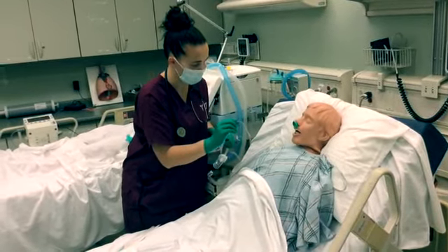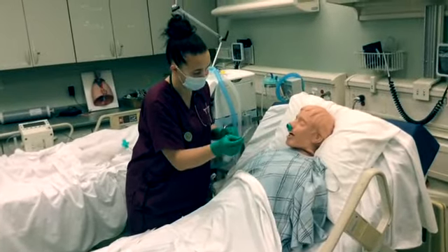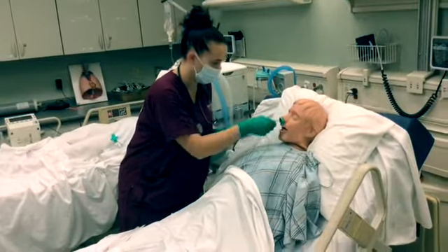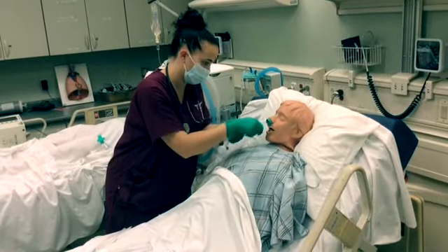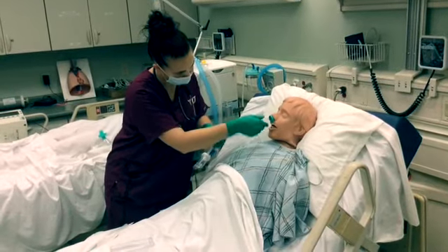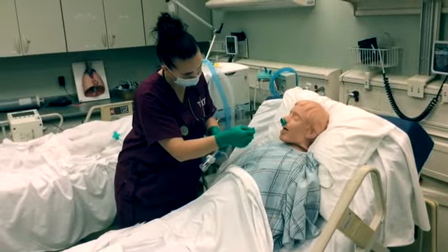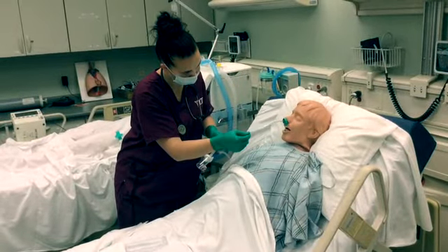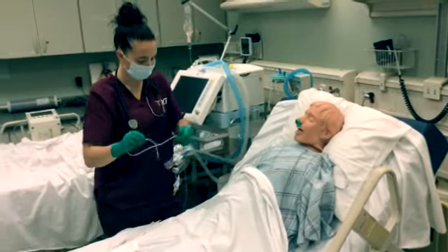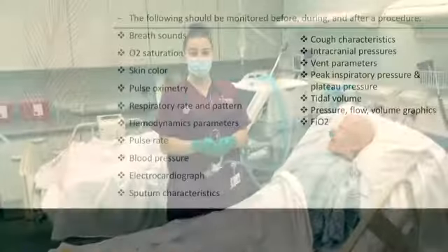And you give them a couple minutes. This will provoke a cough, and that's what we want. And then you will do it again. And that is how you close suction, open suction.